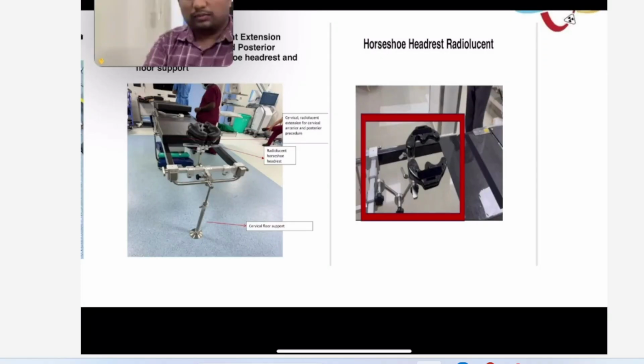I can proudly say that before me and after me in India, the carbon fiber segment, in almost 5 years, has drastically improved among surgeons, spine surgeons and neurosurgeons. The big companies come and sell, but carbon fiber is made by only a few companies in the world. Why? The main thing is cost. The second thing is that it is not widely available or widely used.